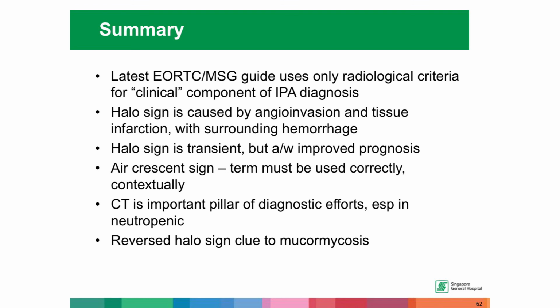And CT, as you know, is an important pillar of our diagnostic efforts. I think nowadays we don't doubt that. We all do CT scans at the drop of a hat. And if you see a reverse halo sign, then the drug to start is AmBisome rather than voriconazole.